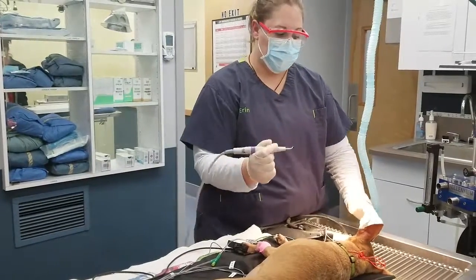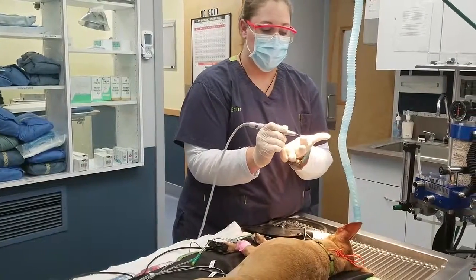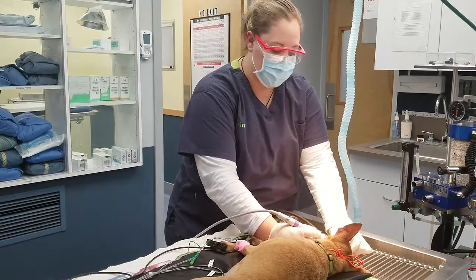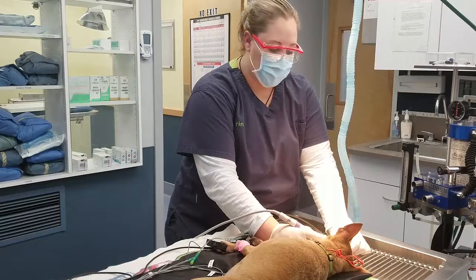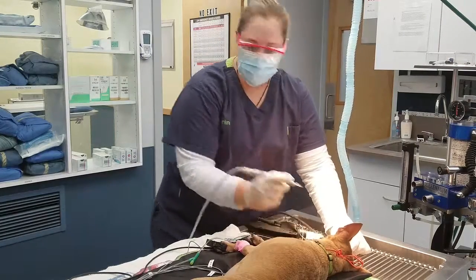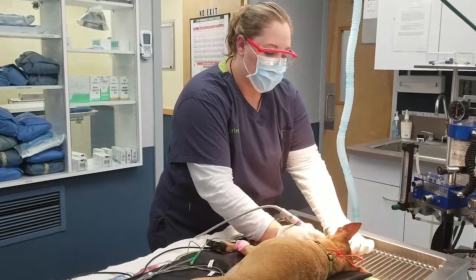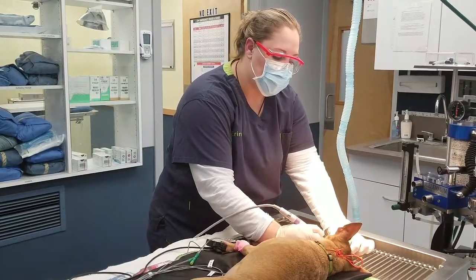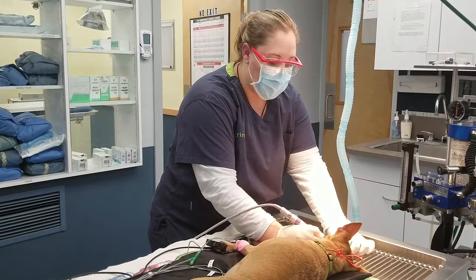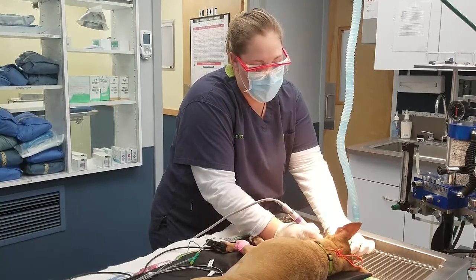For scaling with an ultrasonic or a piezo scaler, we're going to take the lateral surface of the scaler along the tooth, and we're going to spend about 2 to 10 seconds per tooth scaling off the hardened calculus and the tartar. I'm going to use my foot pedal to start the scaler. We're only going to use the lateral surface of the scaler. Using the tip of the scaler can harm the tooth and do damage.